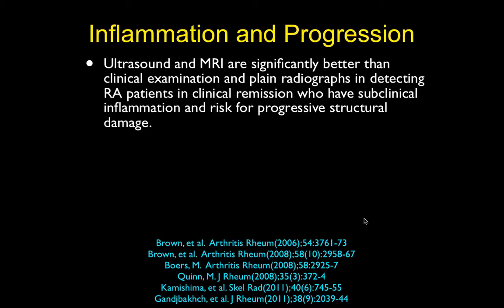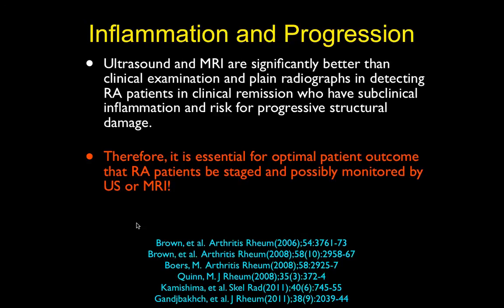So there are a number of papers now that have done ultrasound and MR imaging of patients who are being treated and have complete remissions. So they have symptomatic rheumatoid arthritis, they get treated, they have no symptoms, and then you follow them with imaging. And all of these papers have shown that a substantial number of patients who are clinically in complete remission will actually have ongoing inflammatory disease, and you can see ongoing destruction of the bone even though they don't have symptoms. So they believe now that following these patients clinically alone is inadequate to provide the best outcomes. And therefore they recommend evaluating the patient with ultrasound and/or MR, even if they have clinical remission. And if you start seeing osteitis or new erosions, then they need to go back on higher level treatment in order to stop the bone destruction.